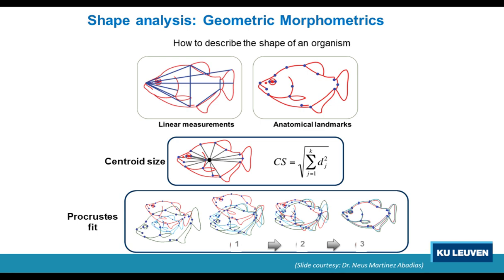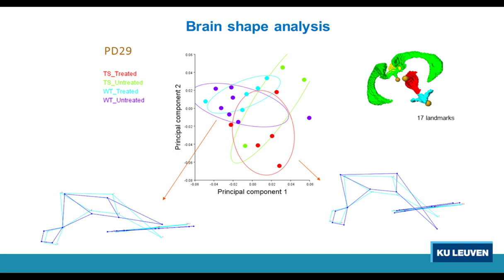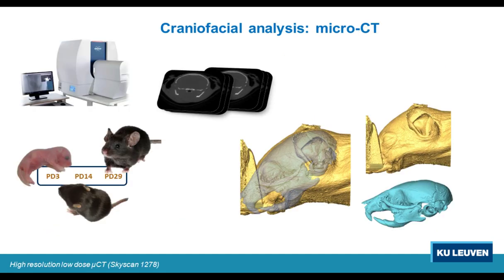So we can really analyze based on geometric morphometrics, come up with this type of data on shape, on size, on bending, so really on the differences in brain anatomy that are typical in Down syndrome. And then obviously we can also in a very quantitative manner evaluate whether the treatment normalizes this and has a beneficial effect on this or not. So that's the research we're currently conducting with the help of our MR imaging.